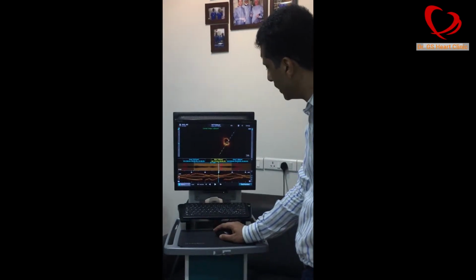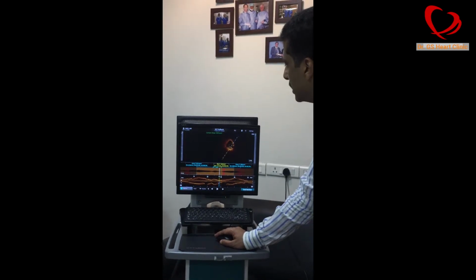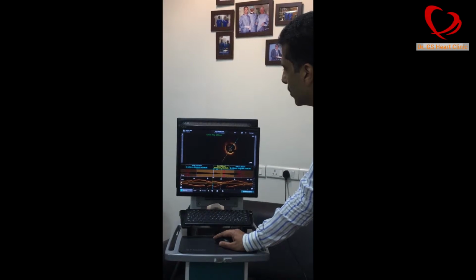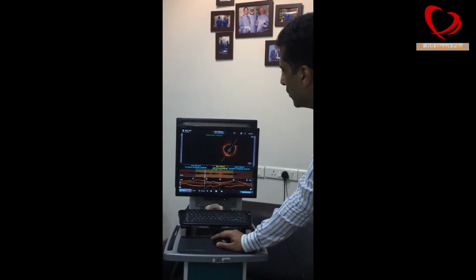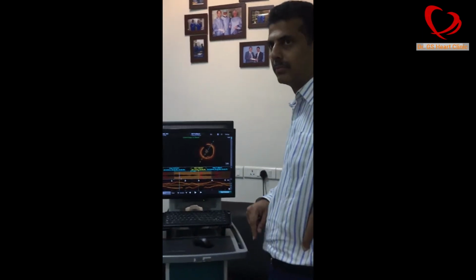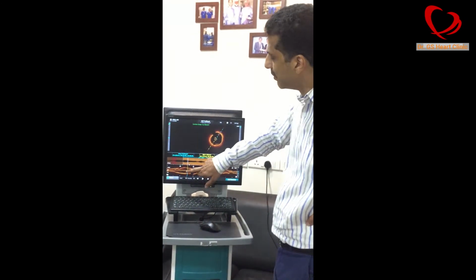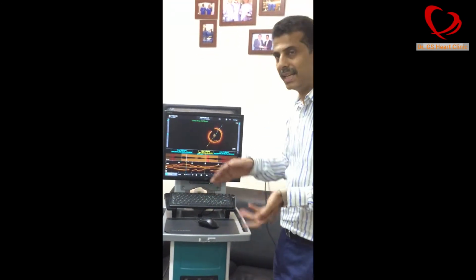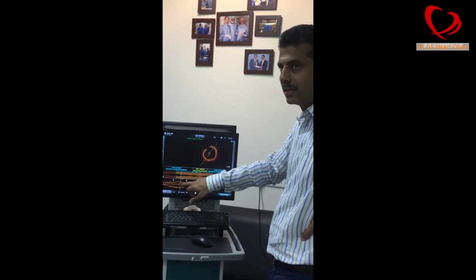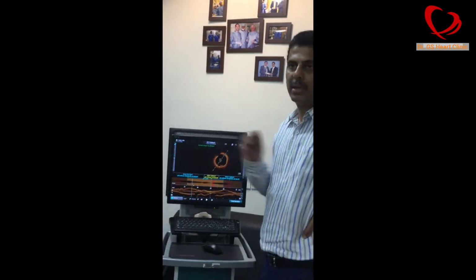As we are moving more and more, the area is increasing, but then it comes to 5, 6, 7, 8, 10, 11, 12. Here you get a big one again. You see, again big, 10 and 12. See, 12 here. So it means the actual lumen is 12. For him, that particular point is coming to 1.8. This area is 12. For him, this artery is a little big, by nature it has a bigger diameter. So the area is quite big here. The problem is this area is so tight that the blood is not able to pass through.